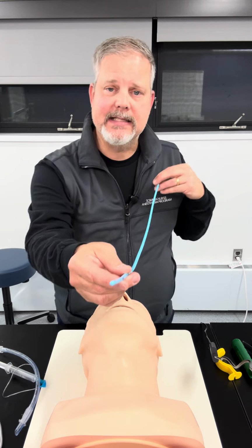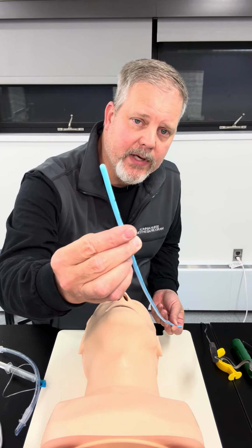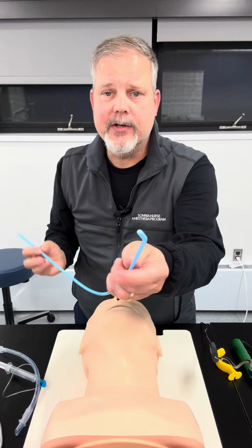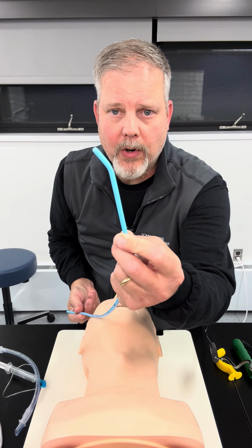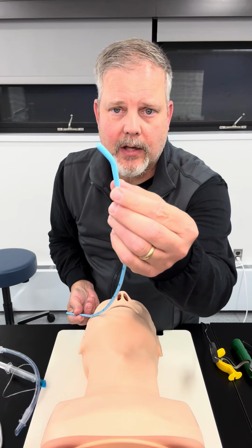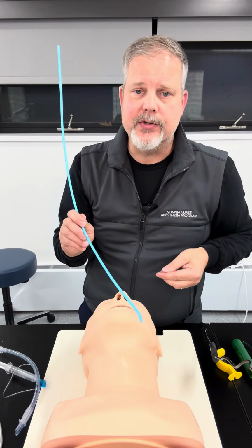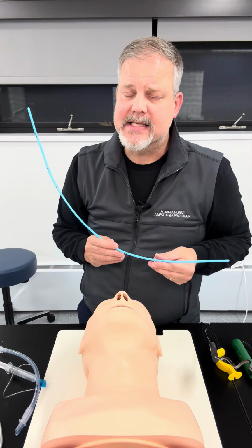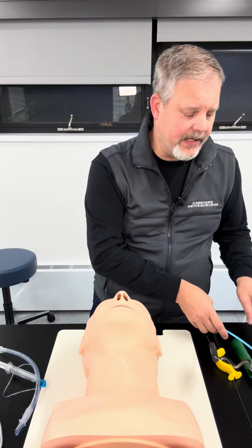And what you're going to see, if you can look at it here, is two different ends of this. You're going to see one end that is straight, and then one end that has a curvature to it. So we're going to be placing the end with the curvature down in through the airway and into the trachea. And there's a specific purpose behind that, which I'll go over with you in just a minute.